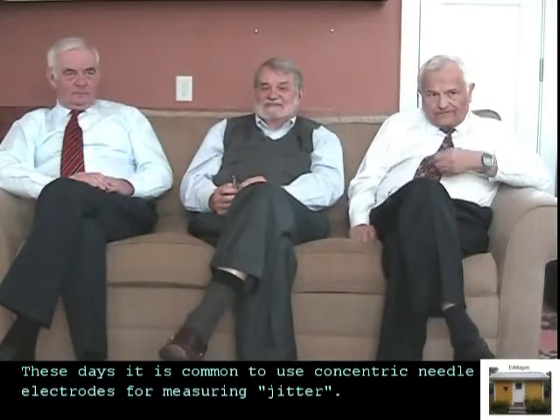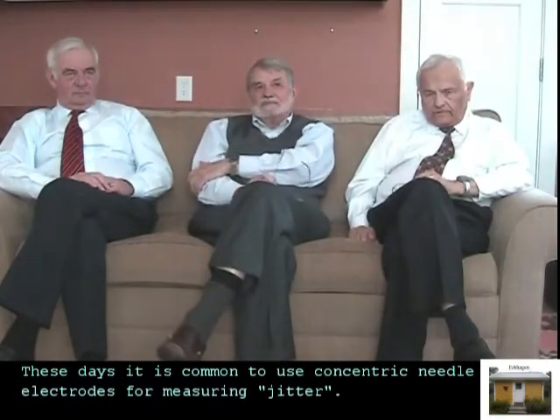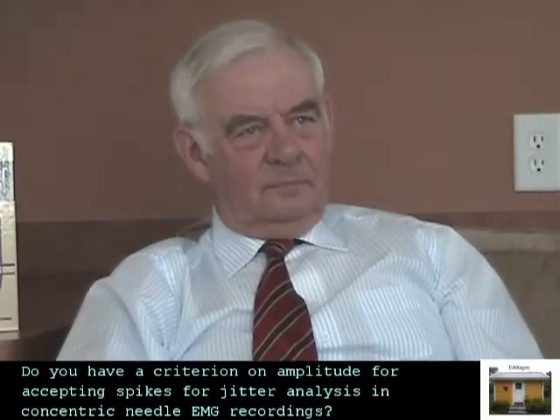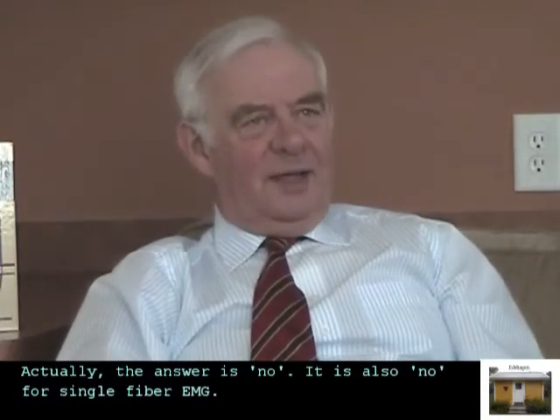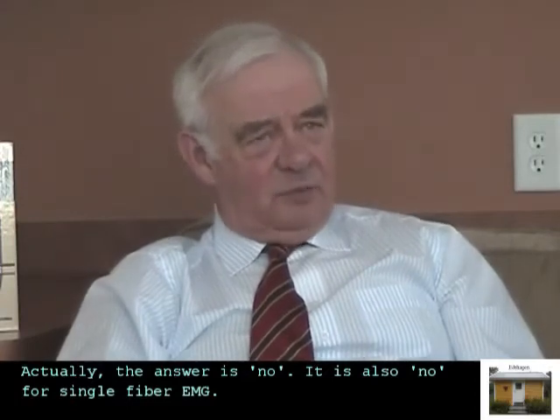These days it is common to use concentric needle electrodes for measuring jitter. Do you have a criteria on amplitude for accepting spikes for jitter analysis in concentric needle EMG recordings? Actually, the answer is no. It is also no for single fiber EMG.